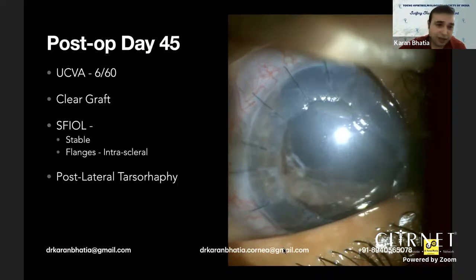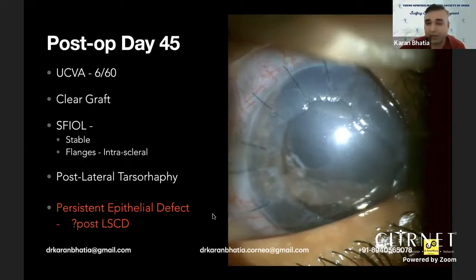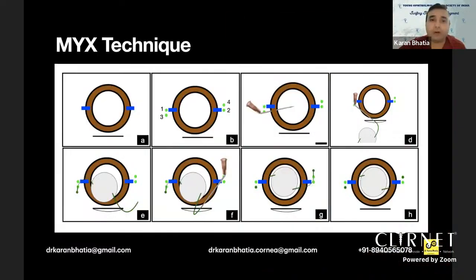The thing is, there was a persistent epithelial defect which was being managed. Again, he's lost to follow up now. But the point that I'm trying to say is that you can even do it in an open sky procedure. This is the post-operative day 45 follow-up.